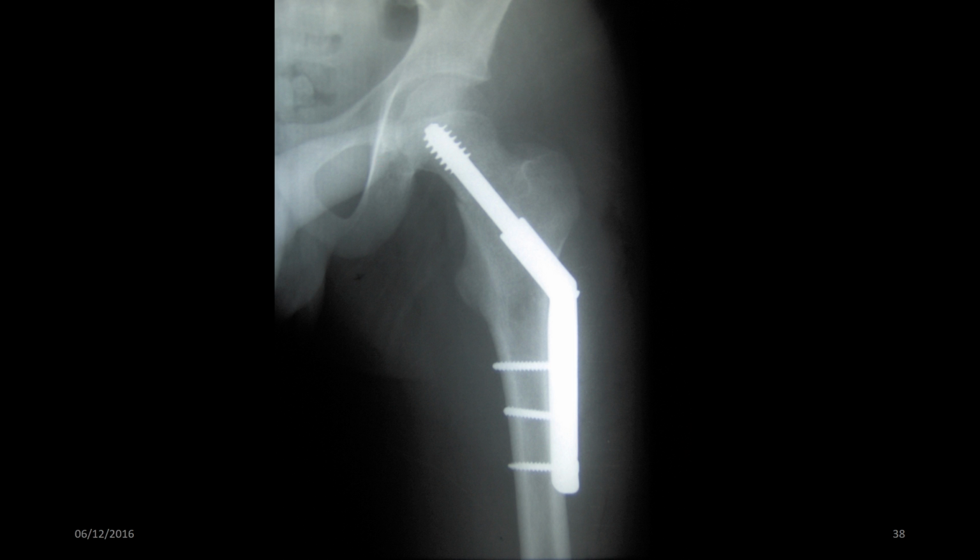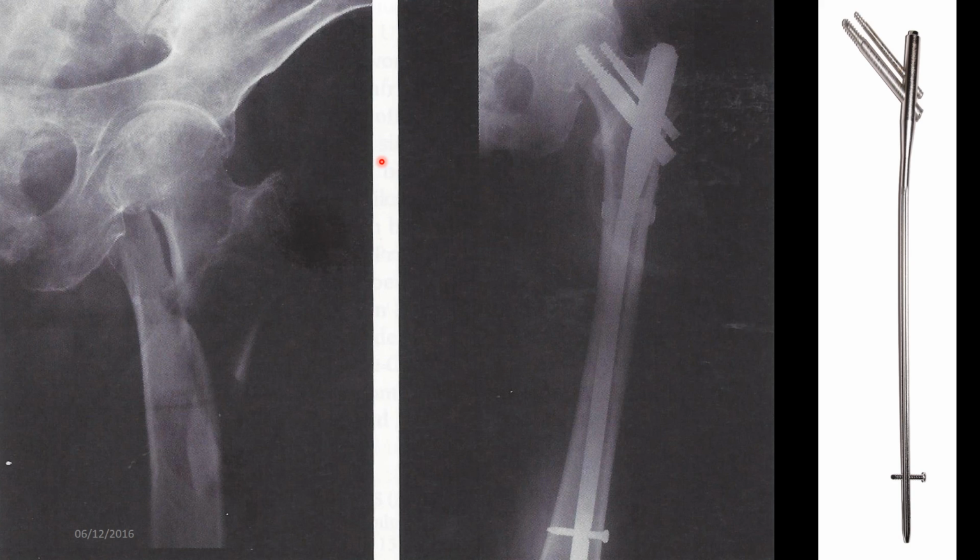Unfortunately, I do apologise. I believe the next images are potato quality because it's actually hard to find a decent image of a PFNA because no one really knows what they are. So as you can see here, this is the femoral head, and this is the neck of femur here, and these are the greater, oh, and there's a fracture. It's fractured below the neck of femur here, and so they can't put a screw straight through there and place it at the side. They have to stabilize the whole thing because this is a weight-bearing limb, the femur.